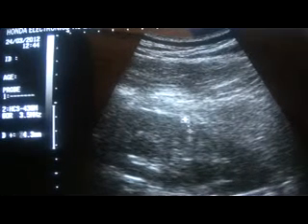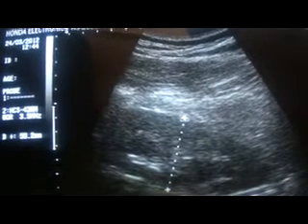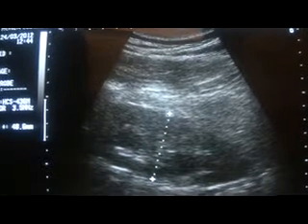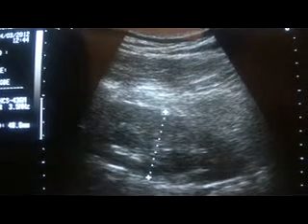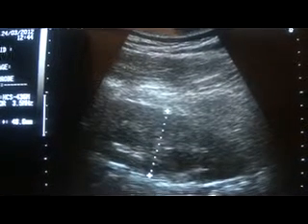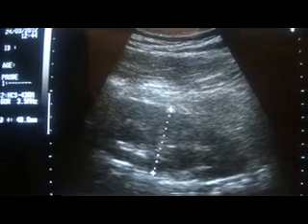It's in its distal end, and this is the prostate gland. This is the seminal vesicle. While moving, now you see this is the seminal vesicle. When I move the probe, this becomes the ureter in longitudinal section, with a calculus of approximately 9.8 millimeters impacted in it. So this is the cause of the gentleman's problem of obstructive uropathy that we saw initially.